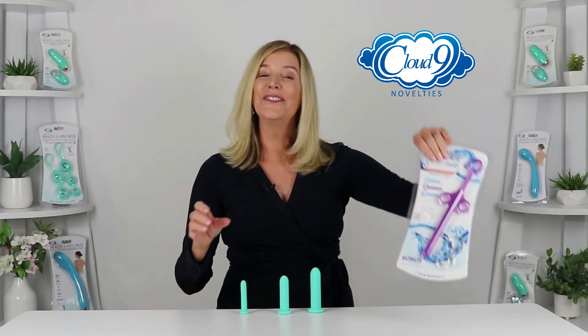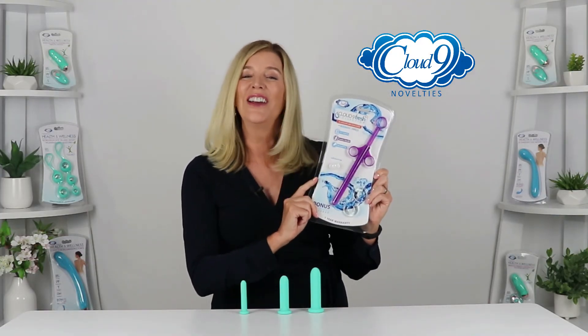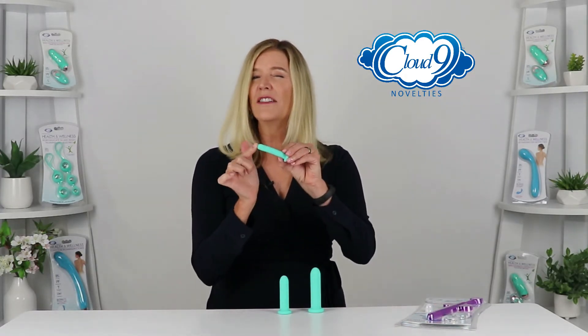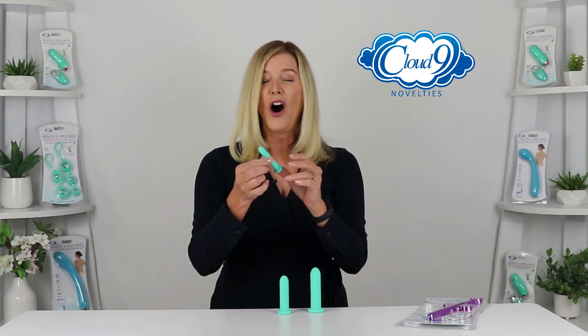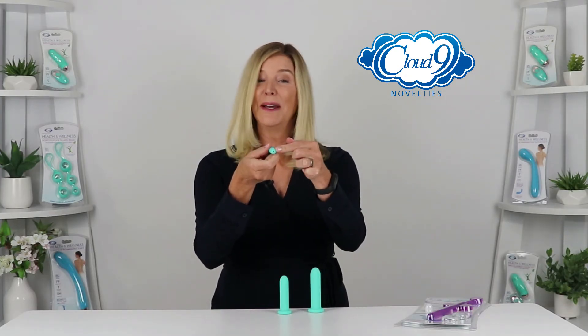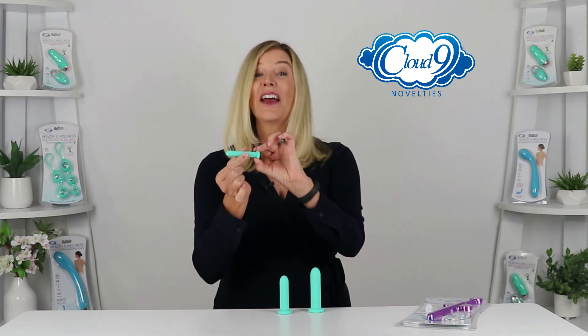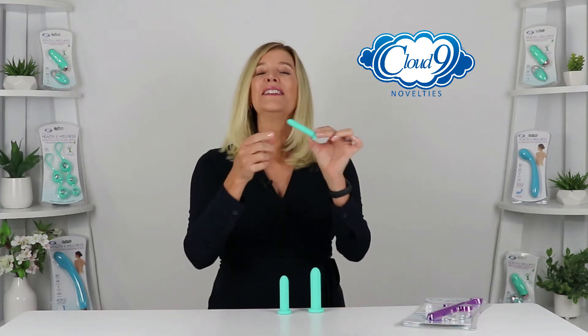And this is Cloud9's Lube Injector, which is a great pairing as a lubricant applicator. Plus, close-end dilators can cause a natural suction, which might be uncomfortable, and it definitely makes them harder to remove. All of these three silicone graduated dilators have an open tip, allowing for airflow, making them easy to maneuver and to remove, especially with their tapered comfort bases.